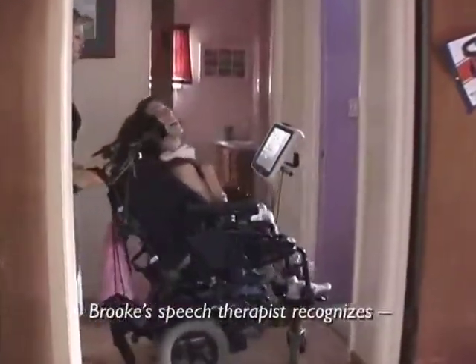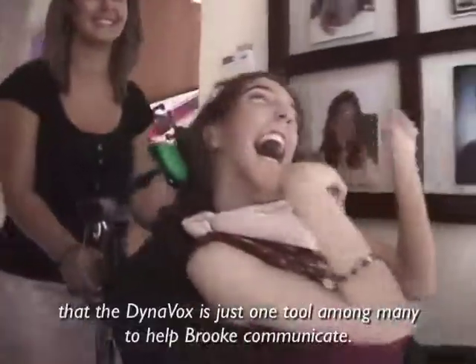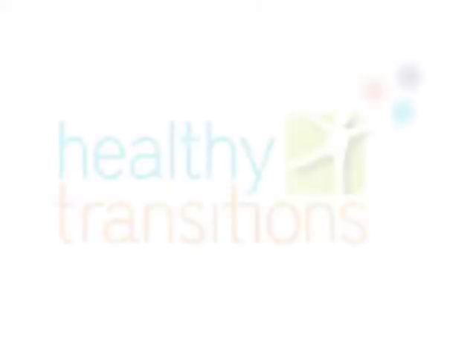Brooke's speech therapist recognizes that the Dynavox is just one tool among many to help Brooke communicate.